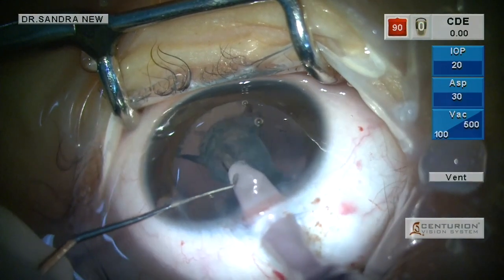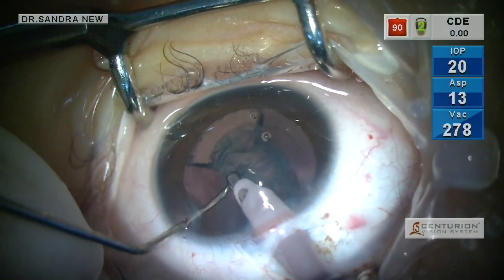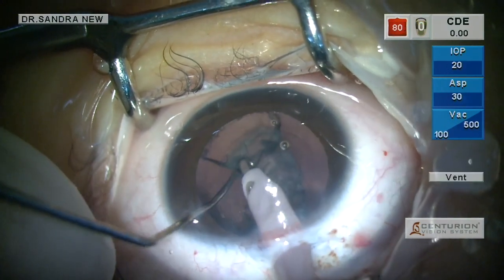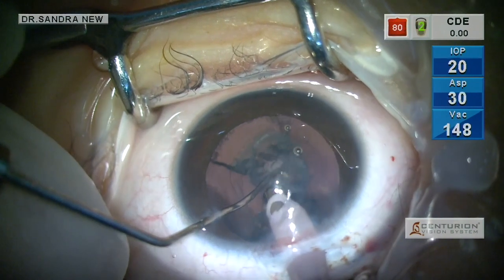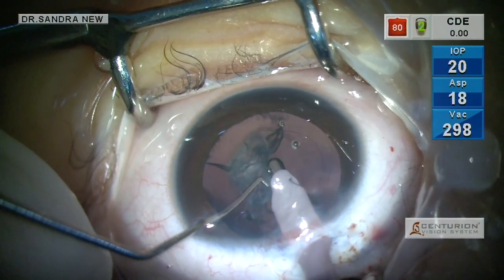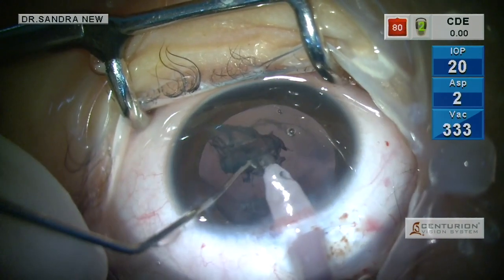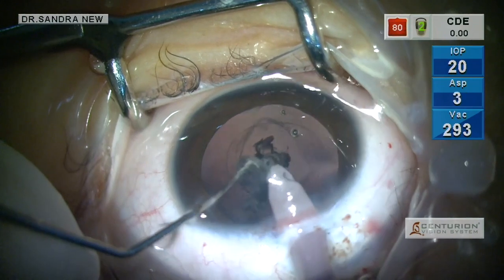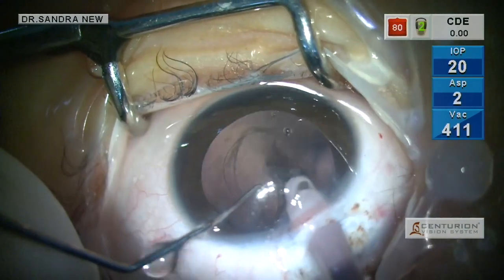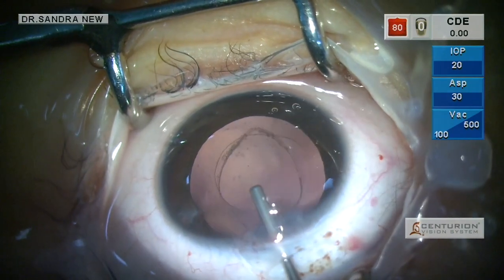Here, owing to the presence of the posterior capsular defect, I am mostly aspirating the peripheral cortex and keeping the center as a buffer almost till the end. You can see the margins of the posterior capsular defect. Very carefully I am aspirating the last part of the cortical matter, taking care not to drop any fragments through the defect into the vitreous. This is the last cortical piece, slowly being nudged with the second instrument into the irrigation-aspiration handpiece, and only the sub-incisional cortex is left, which is also safely aspirated.